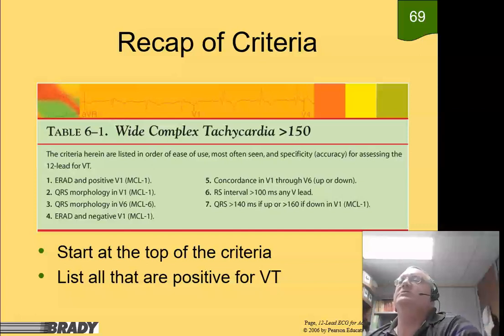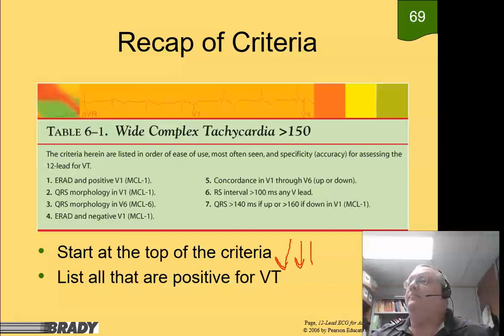Okay, so what do I need to remember? That seems to be the question. Well, not a problem. Down, down, down, up is probably a good one to remember, right? Down, down, down, up. And up would be the V1, right? Down, up, up, down. That's VTAC, all right?